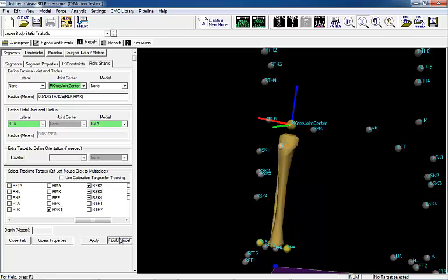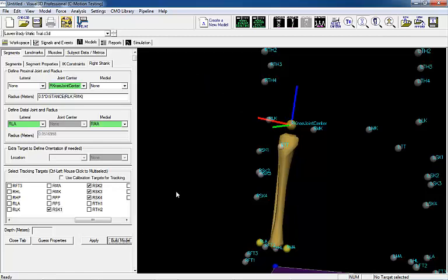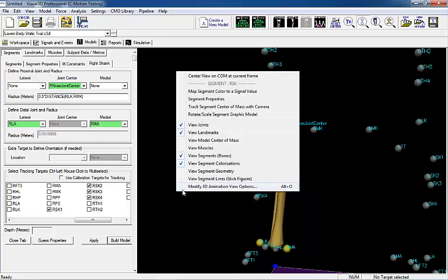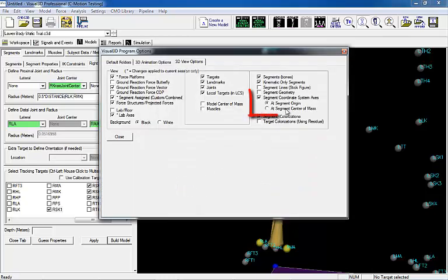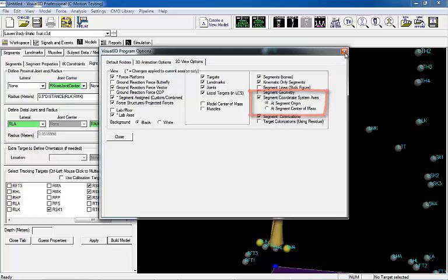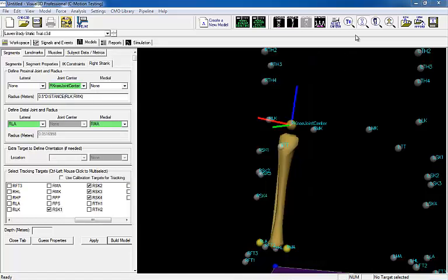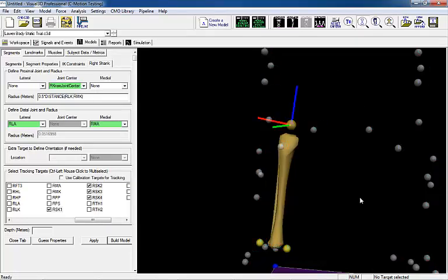Once the segment has been created, the coordinate system is defined at the proximal end of the joint. Although the visual representation of the segment coordinate system can be changed so the coordinate system appears at the proximal end of the segment or the segment center of mass, the segment coordinate system is always defined at the proximal end of the segment.